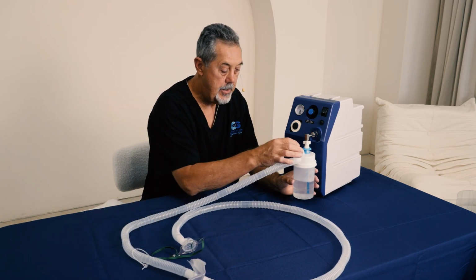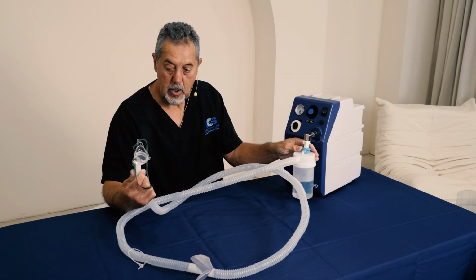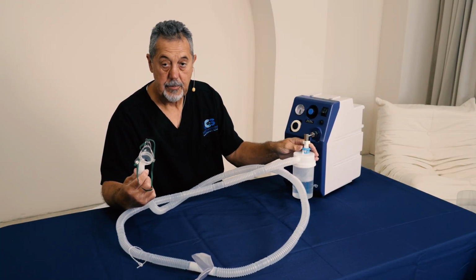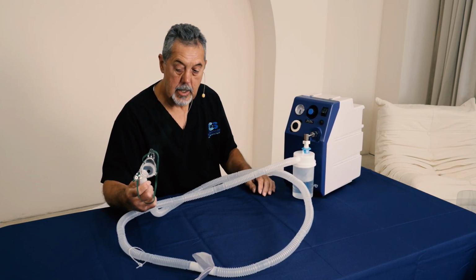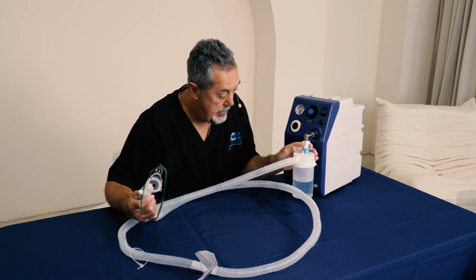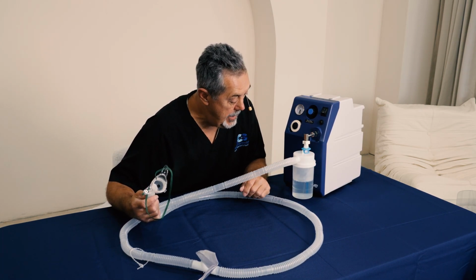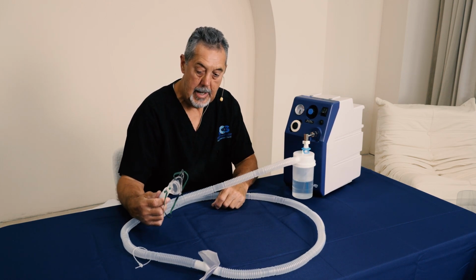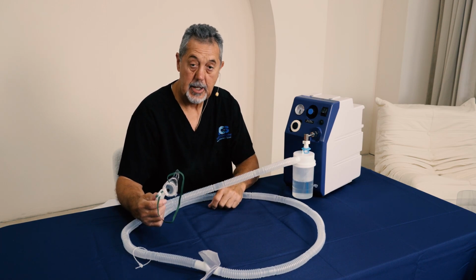In order to do that, you can adjust the large volume nebulizer right here. If you go higher on the numbers here, you're going to get less of a flow. If you go lower, you're going to get more of a flow. I found that when I put it between 35 and 40, let's say more or less at about 37, I get a nice flow, or it's not too much and it's not too little.